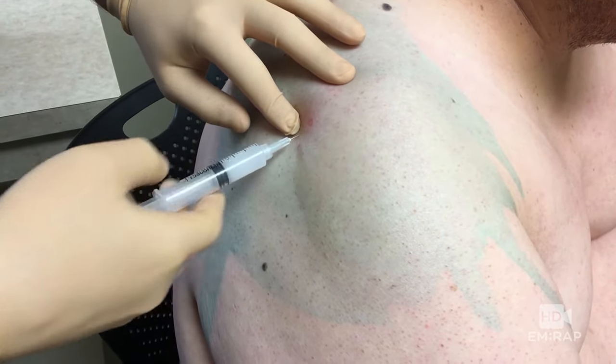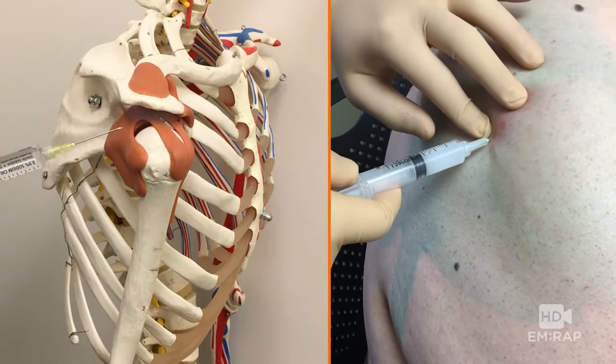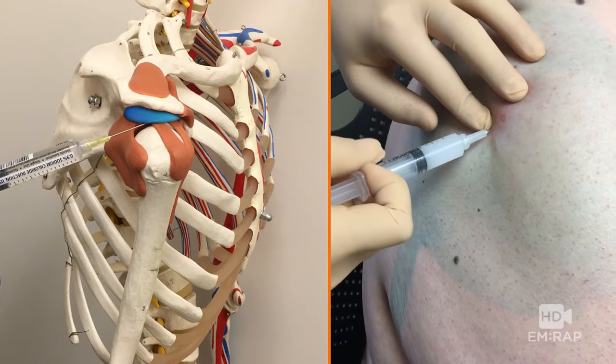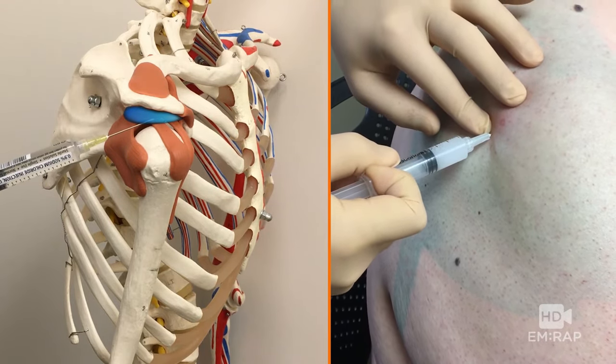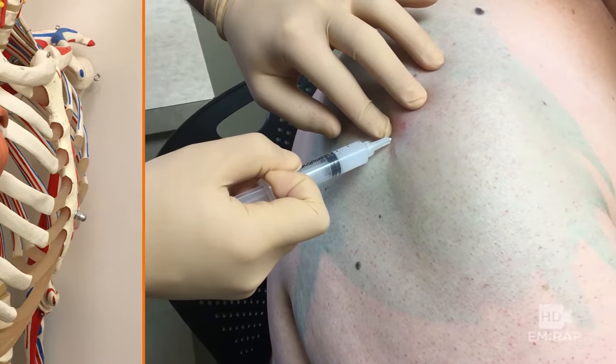In this case, we're just going to go straight in with one poke of the needle. Aim for the spot you marked and angle that needle about 10 degrees upwards from horizontal. Aspirate some fluid if you can, and then inject the medication.